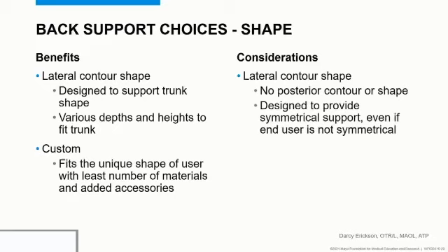But lateral contour, there's not the posterior control sometimes. So with someone there, you kind of feel like you've got control of them laterally, but there's this big gap in the middle. And sometimes when you have users who have more lordosis, they complain a lot of low back pain because they're doing well laterally, but they're feeling like they don't have any of that low back support. And so either they tend to slump more and try to get more contact, or they try to sit up taller and they want everything taller to try to contact them and keep them feeling comfortable.